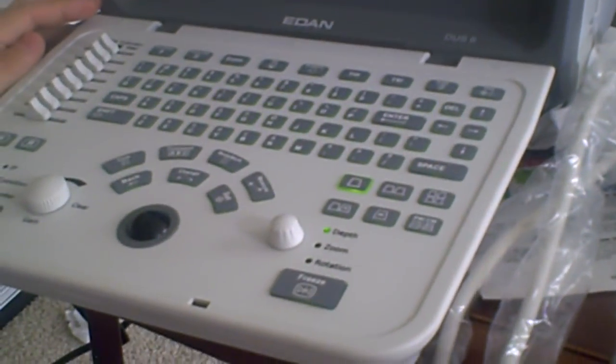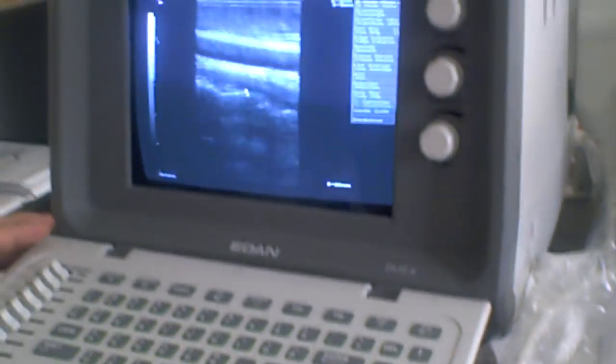I'm going to pan back out here once again just to see the machine and the keyboard, and of course the ease of use.